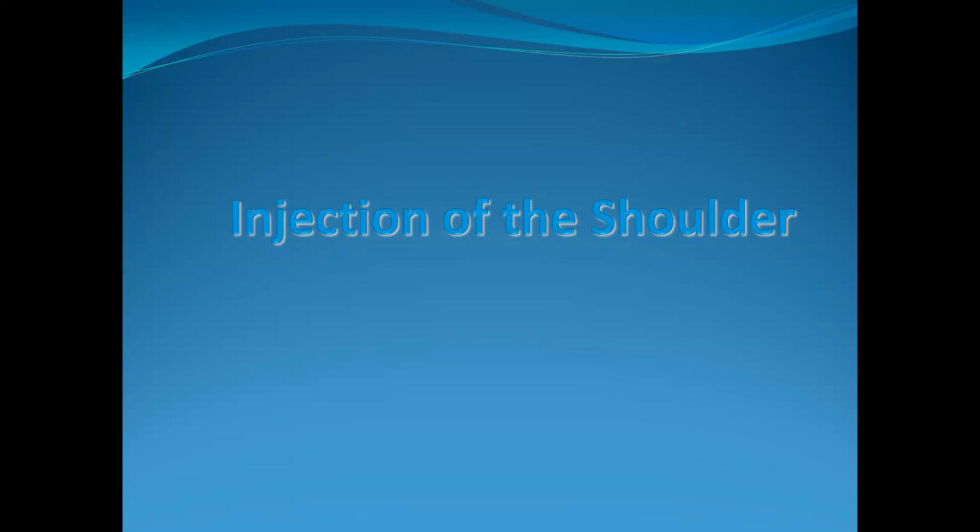However, I will suggest if there is no effusion, please don't prefer the suprapatellar pouch area. The best way is the mid-lateral approach for the knee joint, where the joint is almost superficial. Just the lateral retinaculum is there between your joint and the needle. So it's very easy. Go through the mid-patellar or even supralateral, just at the upper pole of the patella. If you direct your needle up or down, you will hit a bone. Hitting a bone also confirms that you are inside the joint.